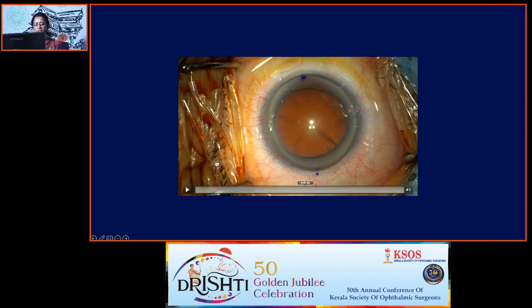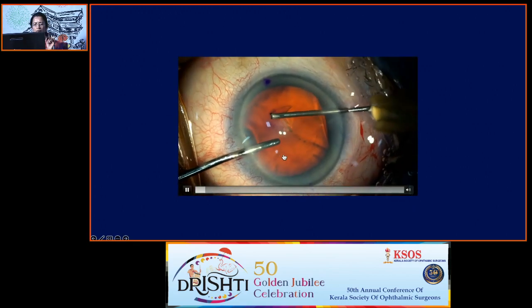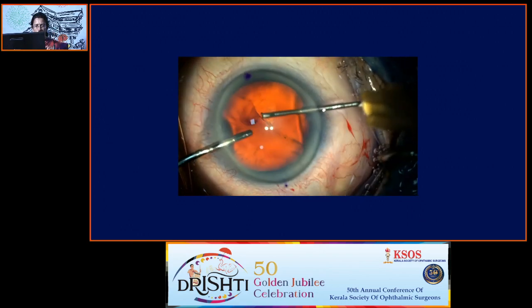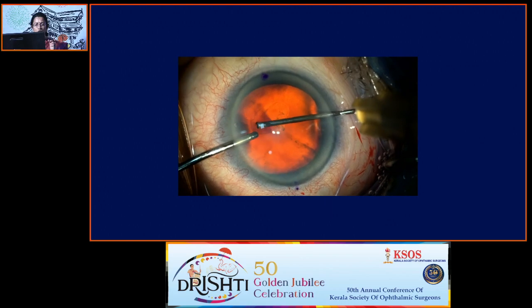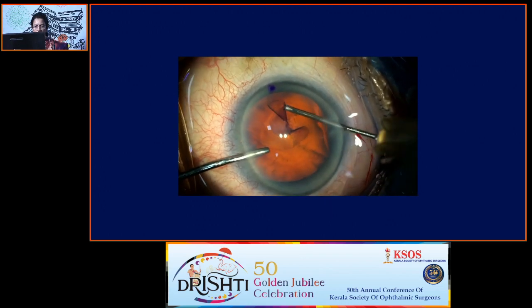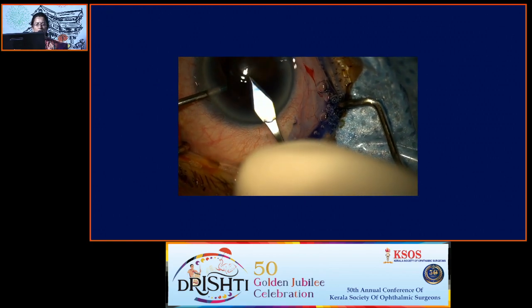you have to mark the cornea where it touches the limbus. Now this patient is lying down under the microscope after the reference mark. You can see here, you should mark the cornea and not the conjunctiva, because the conjunctiva is mobile. The rhexis should be round and it should uniformly overlap the IOL so that the IOL position remains stable.